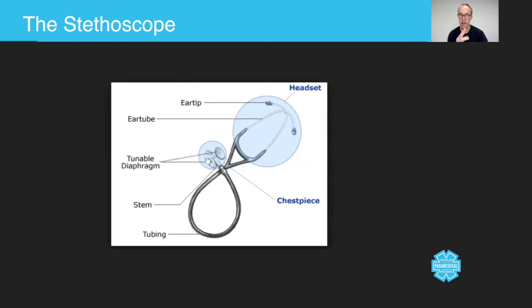They're used for listening for different types of sounds. And with both of these, the bell and the diaphragm, the harder you press on the patient's chest, the more you're going to hear. And that's basically it. So you've got your ear tips, your ear tubes, this is just a piece of metal or aluminium, you've got your tubing and the diaphragm and bell.